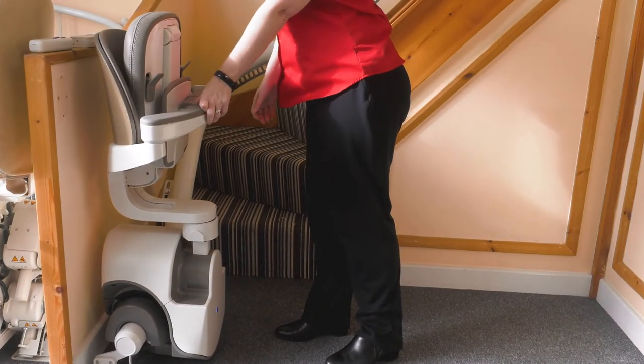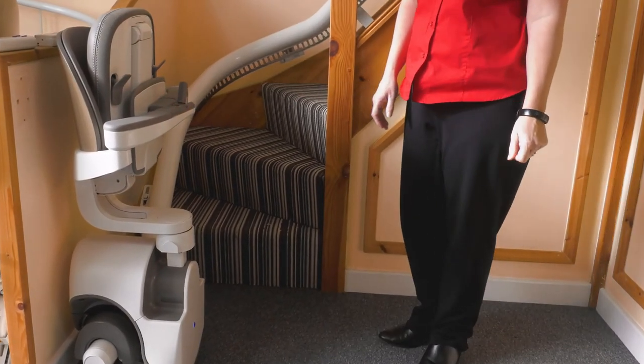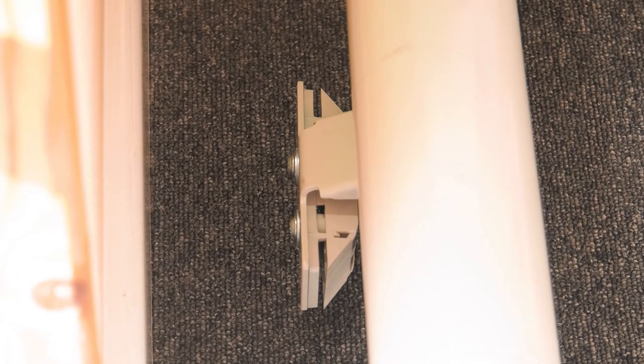All stair lifts are battery powered and charged by parking the lift on a charge station. This is normally found at the top and bottom of the rail, or sometimes at an intermediate or mid-landing charge station. A battery charger unit will run from the main socket in your house. If you have a power cut the lift will still work. If your stair lift is bleeping, that's because there is an audible alarm telling you there is no power coming through to the lift, meaning it is either off a charge station or the power point is switched off.